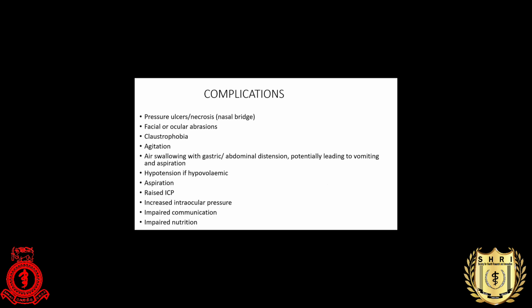What are the complications? In general, when we use this tight-fitting mask, it can cause pressure ulcer or necrosis, especially around the nasal bridge in elderly people. It can also cause facial and ocular abrasion and eye irritation. With a loose-fitting mask, there is air leakage from the mask going to the eye and causing ocular irritation.